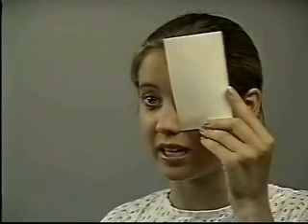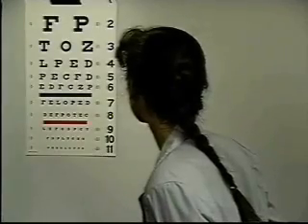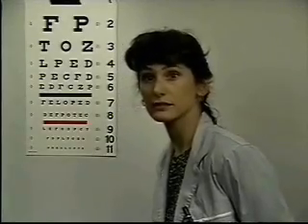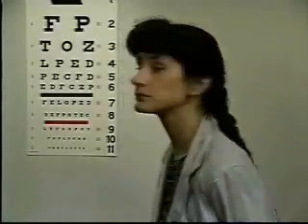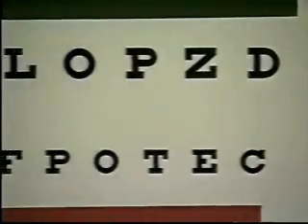F, E. Note the visual acuity printed at the side of the line of the eye chart. E, Z, and D. Now I'd like you to try to read the next line. D, F. Then repeat the test on the other eye. Remember to record visual acuity using two numbers, such as 20/20, which is normal.